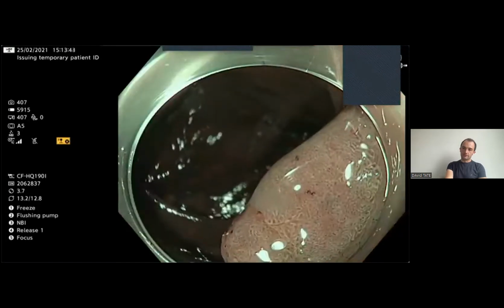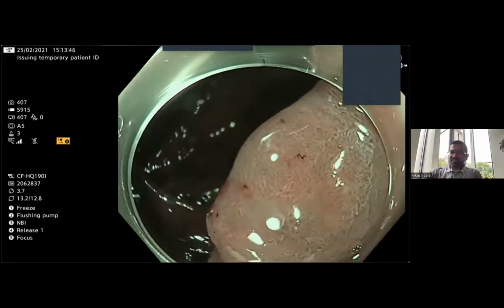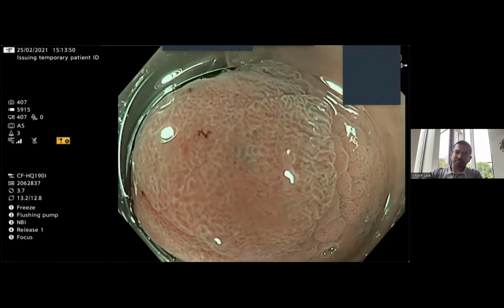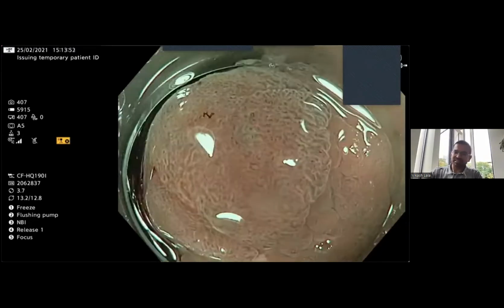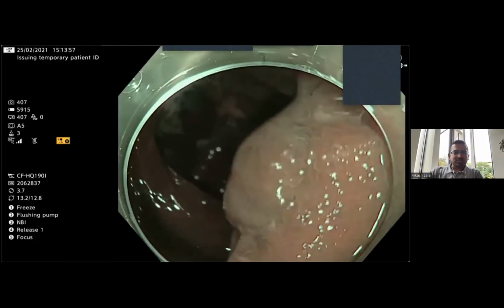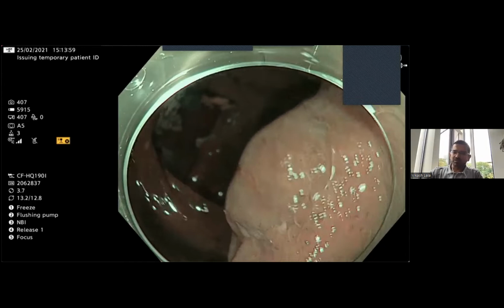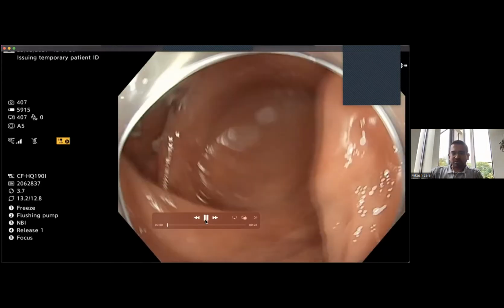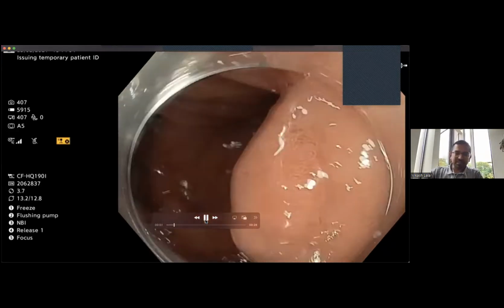What do you think? Okay, so again, like David said, just your first impression or your blink, eyeballing the lesion. There's no obvious demarcated area and no obvious concern for cancer. Then to assess it a little bit more, looking at the Paris classification, the size, the granularity of it. In terms of the Paris classification, it looks like a 2A lesion. It's elevated. It's got no depressed areas. In terms of the size, it's probably about 15 millimeters. And in terms of granularity, it's a non-granular lesion.